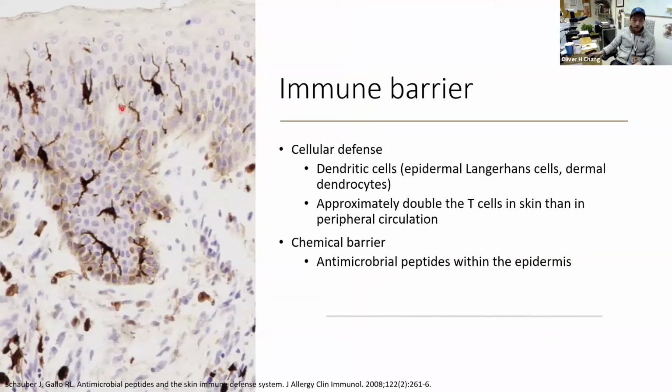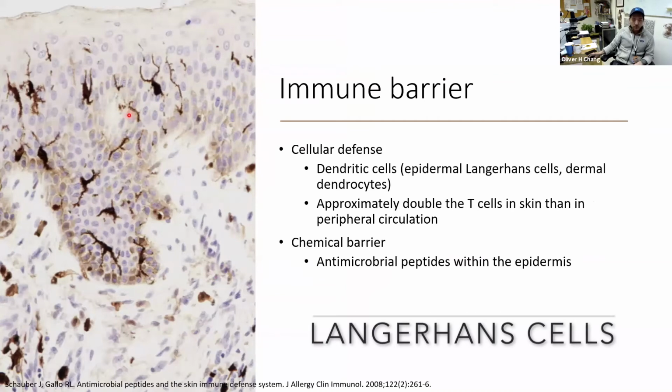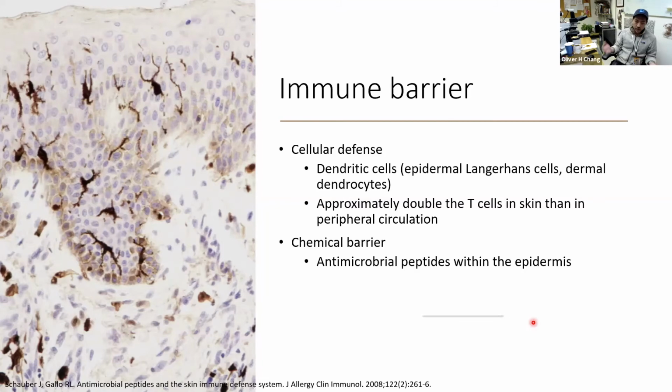These are Langerhans cells, staining with S100. You have these sentinel cells, Langerhans cells, that hang out in the epidermis, and they basically recognize and process external antigens. Then they squirrel away to a lymphatic, go to a lymph node, and show it to T cells. And then you can mount a T cell host response.